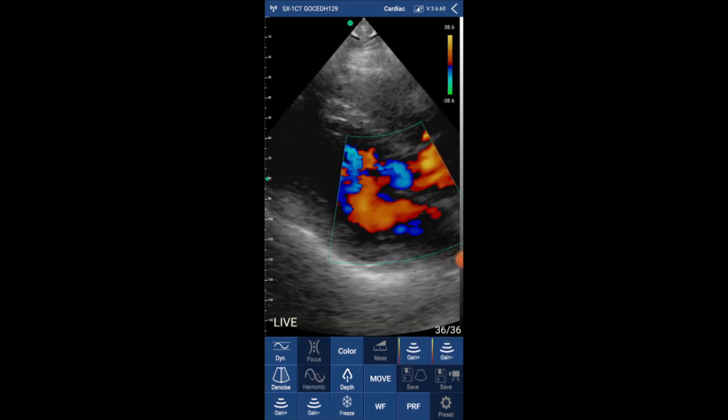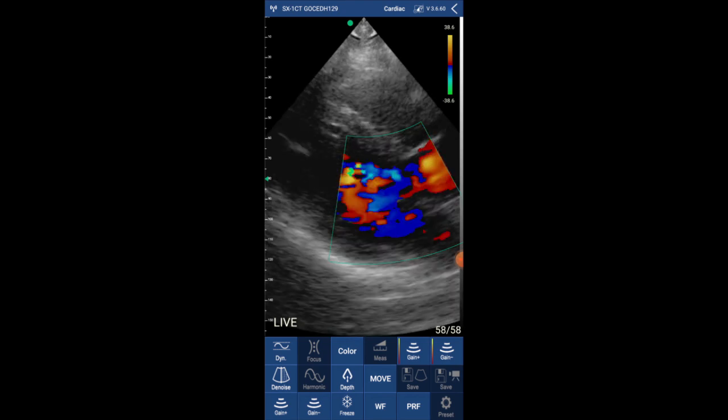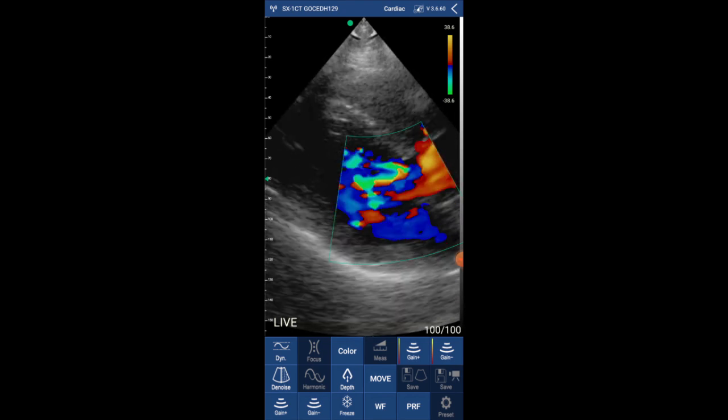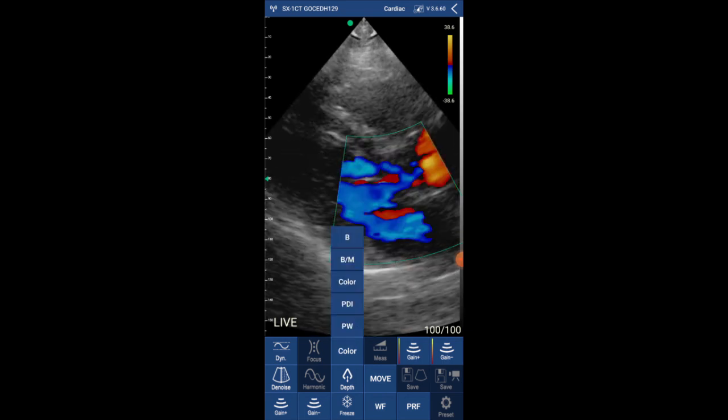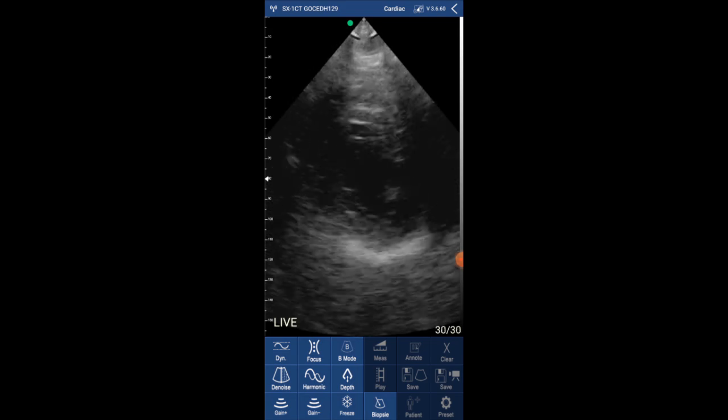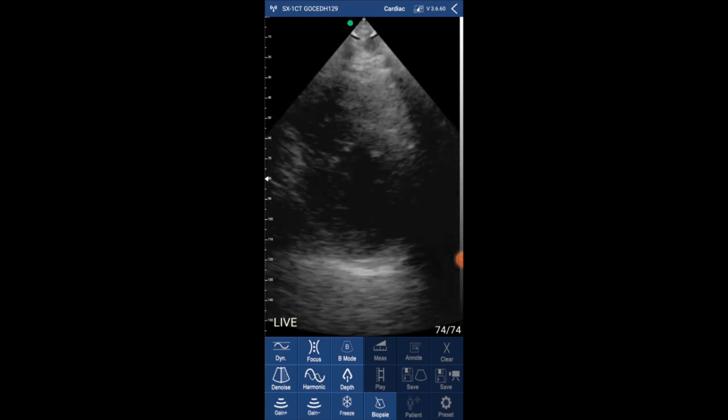Now I'm selecting color Doppler. You can move the color Doppler box, and I'm placing the color Doppler on top of the valves. What do you think about the color Doppler? I will show you a few images I took with this device.